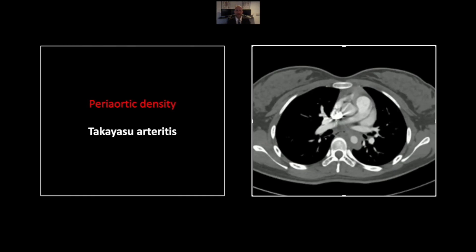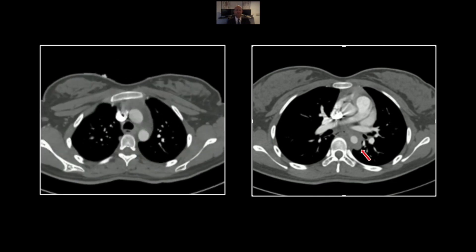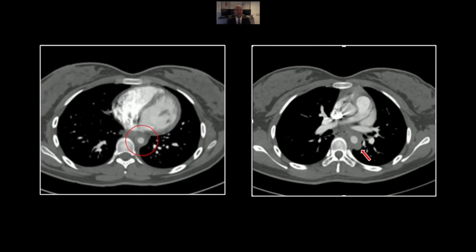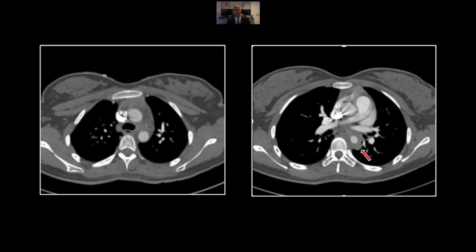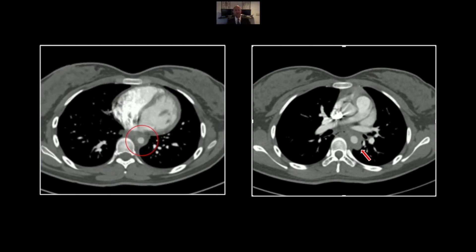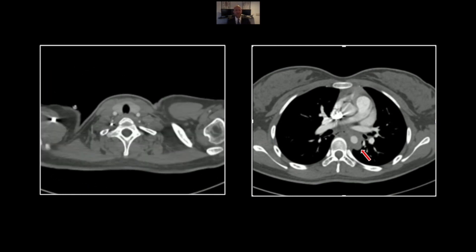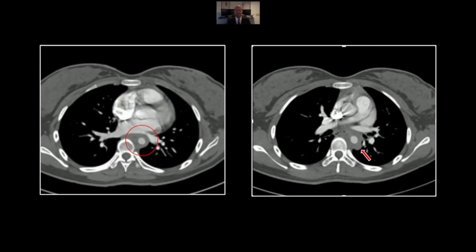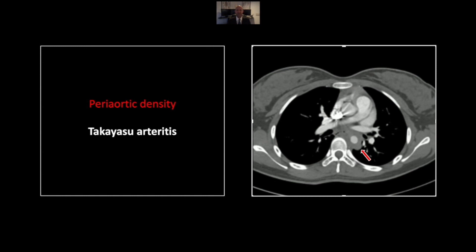Our next case is Takayasu Arteritis. This was in an 18-year-old female — common in young women — often involving the descending aorta with wall thickening and peri-aortic density as you see here. There is variation in the caliber of the descending aorta, varying between narrowing and dilation. There is no specific lab value that can definitively diagnose Takayasu Arteritis, so it is essentially a matter of excluding other potential causes. So that is a case of Takayasu Arteritis.